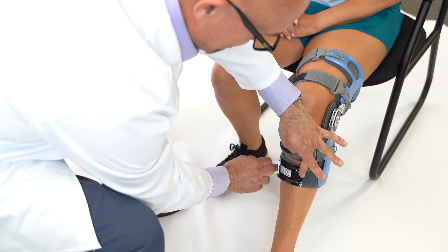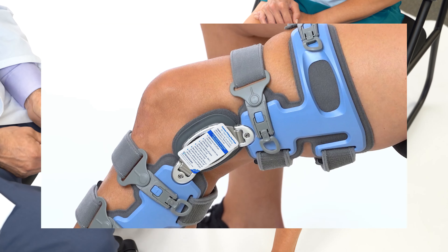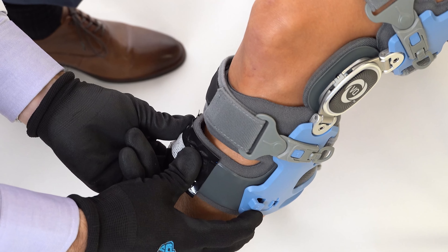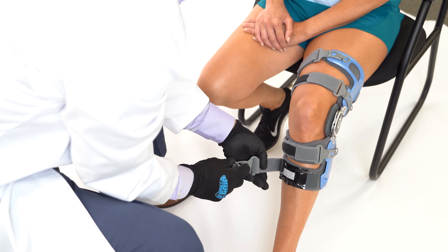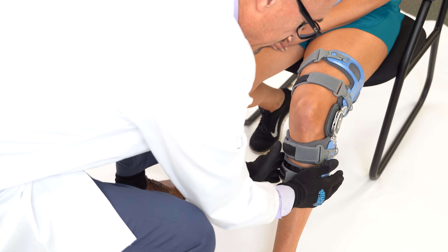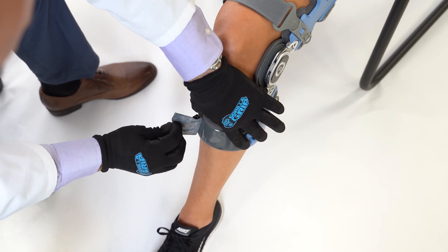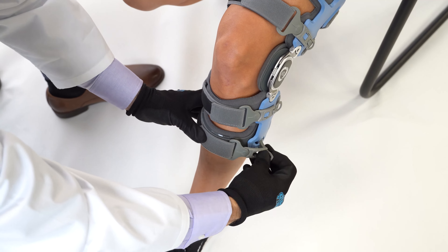To activate heat, peel off the label and stick it to the brace hinge — you will need it later. Wait two minutes, then with gloved or padding-protected hands, mold the cuff to the tibial anatomy. Strap two may also be secured and used to shape the cuff. After three to four minutes, reseal the heat pack center opening with the instruction label, remove the pack with gloved hands, and secure strap two to maintain the shape while the plastic fully cools.